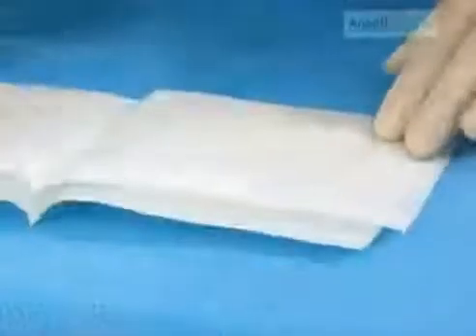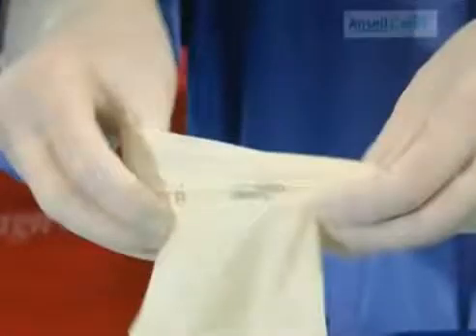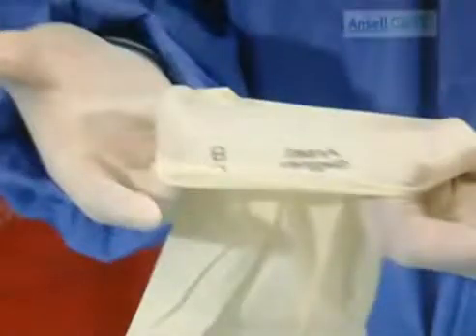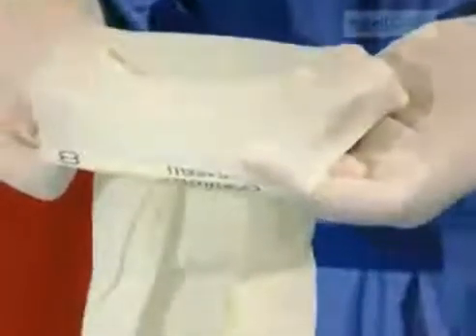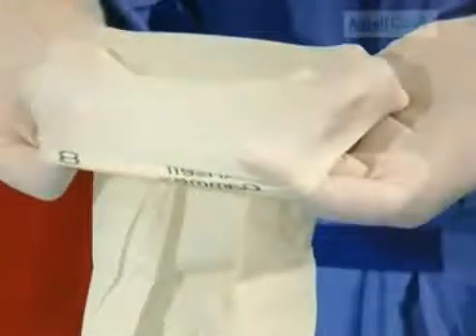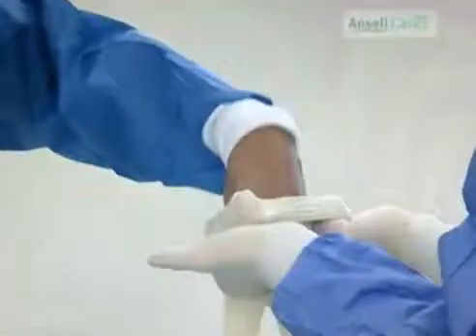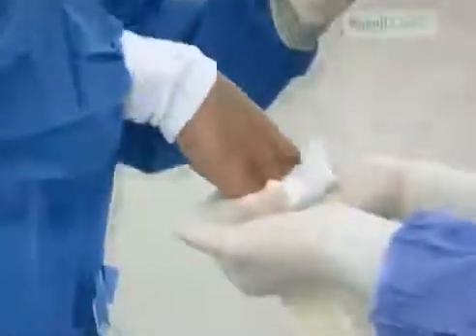Remove the glove and straighten the cuff. Using both thumbs inside the glove and forefingers outside, pinch the cuff edges. Rolling the fingers inward and the thumbs outwards, a cuff is formed over the fingers. Stretch the cuff, pointing your thumbs outwards, wide enough to allow the surgeon's fingers to slide in. Once in place, unroll the cuff over the gown. Repeat for the other gloves.